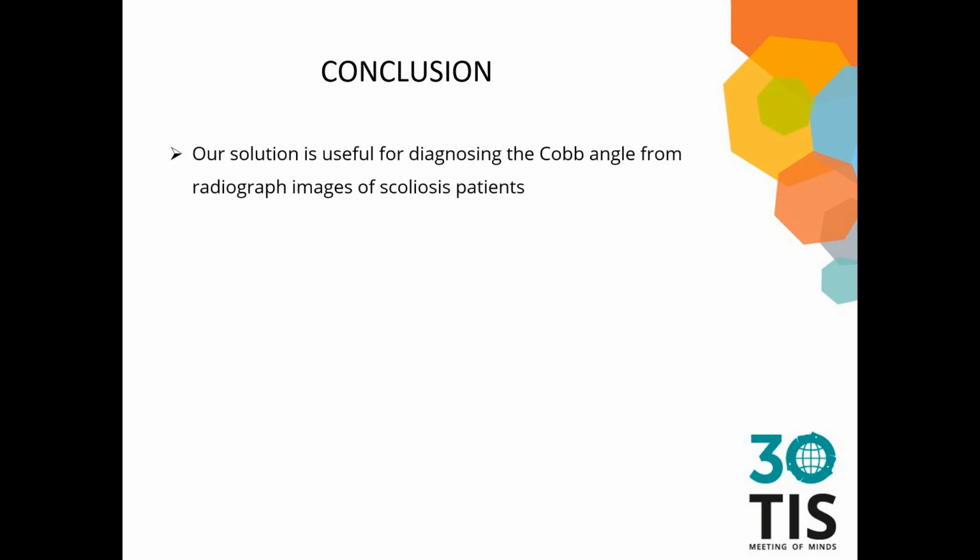In conclusion, our solution is useful for diagnosing the Cobb angle from radiograph images of scoliosis patients. It can be implemented in almost every orthopedic clinic.